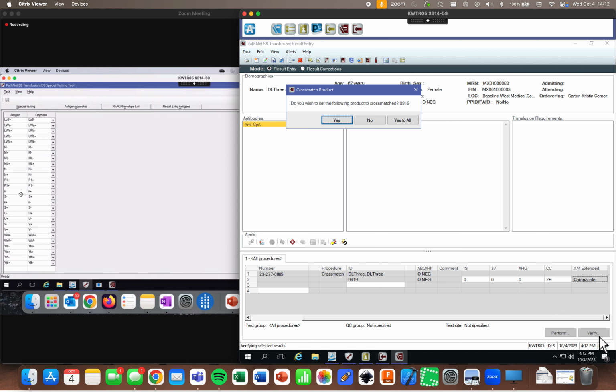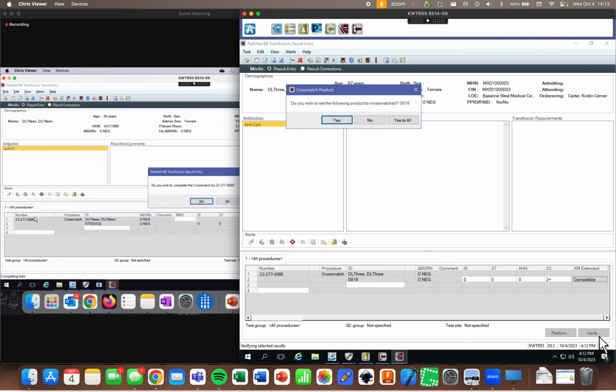So antigen opposites. Yep, you just don't have your opposites. You've got them matched up instead of opposite. So we would just switch this and switch this. It happens all the time. Those pluses and minuses are really hard to see in that tool. And then save that. You could try re-entering the product, and hypothetically, it should recheck that validation. And it should work. Now I'm getting that error.